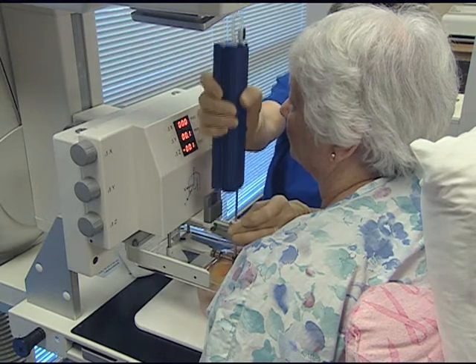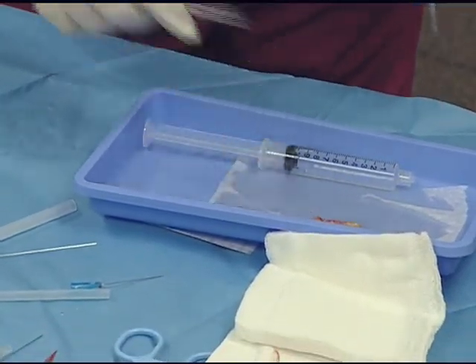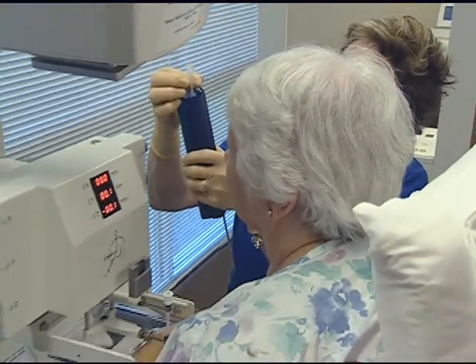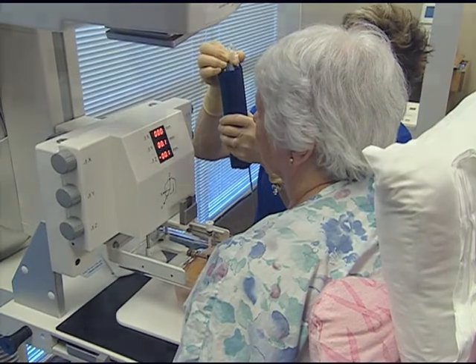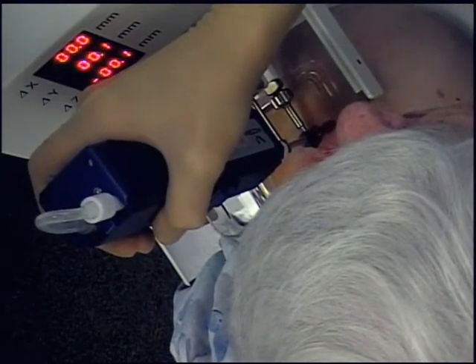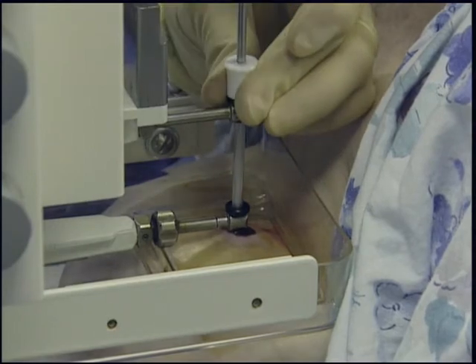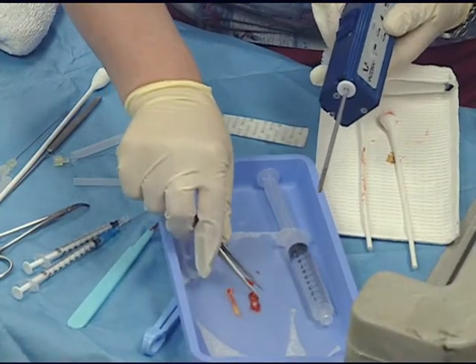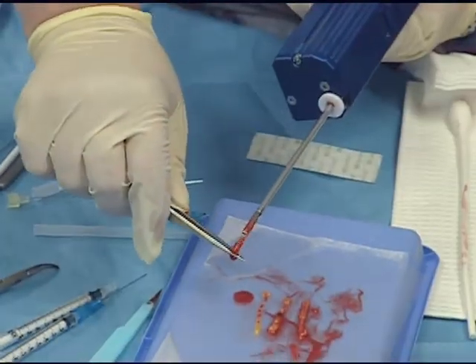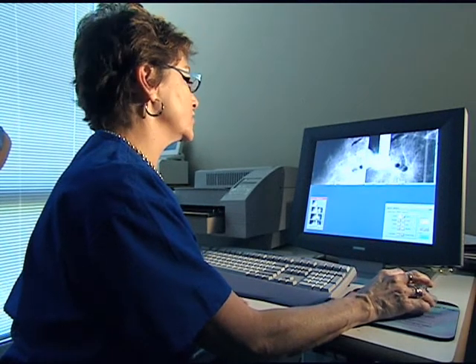Now I'm going to pass this off to Val. There's a little thumb wheel on the top of the needle — I'm going to turn it so that we can go all the way around the clock. That completes the second sample. These are our post-fire images and you can see where the area is a little blacker — we have virtually removed all the calcifications in the area. We can see a few just in the inferior portion to let us know that we're right on our target.